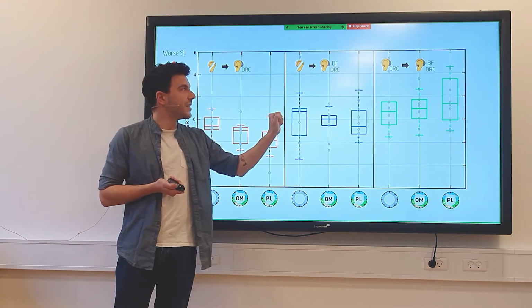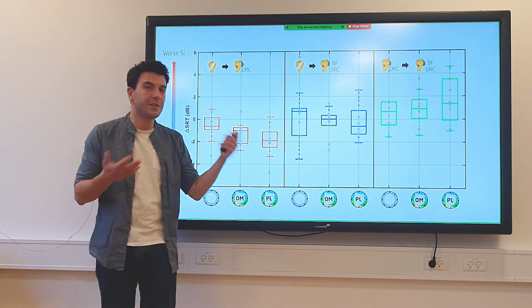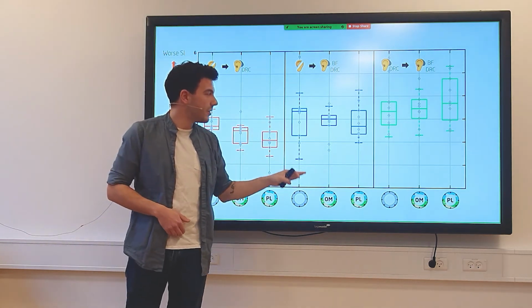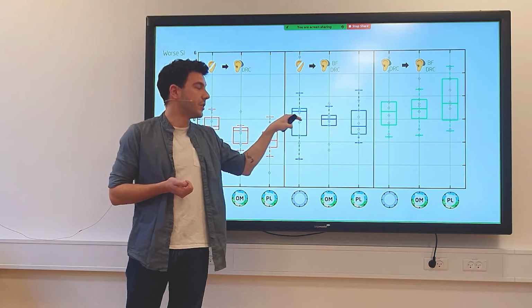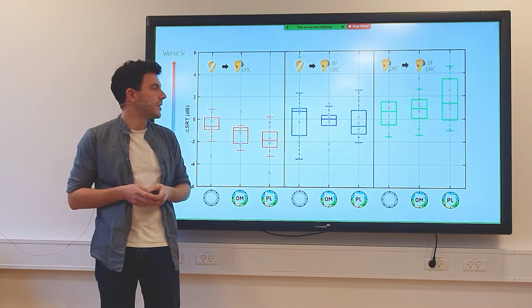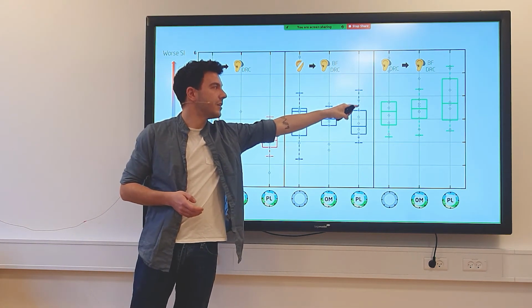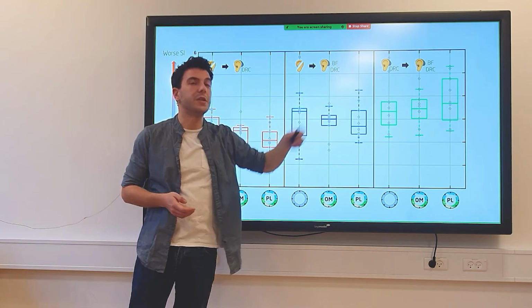However, this is not really the case for the second hearing aid strategy, apparently. Beamforming combined with DRC in our VSE does not improve speech intelligibility to the same extent, maybe slightly here in the second real-world VSE, but not in the other conditions. You also see that in the slight increase in SRT when moving between hearing aid strategies.